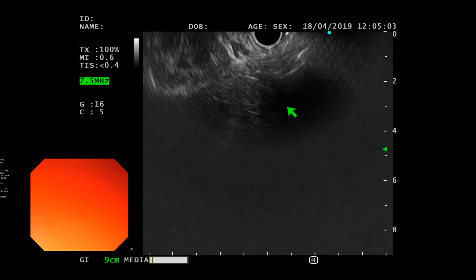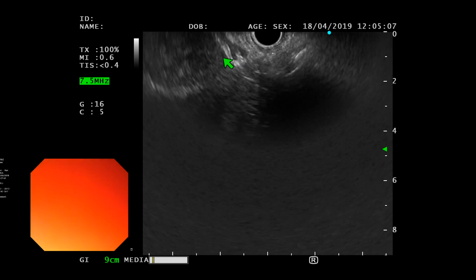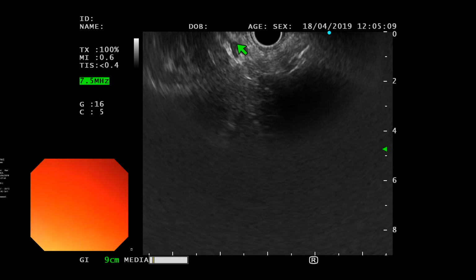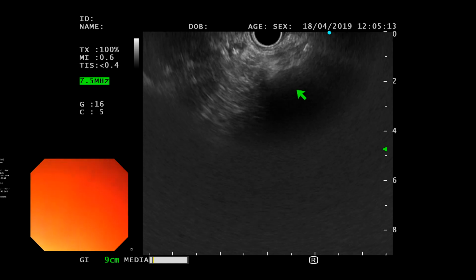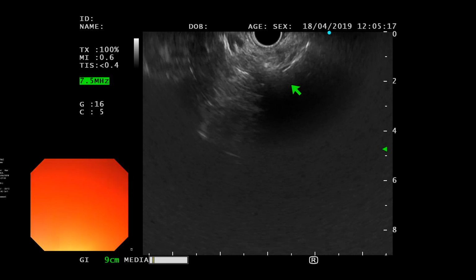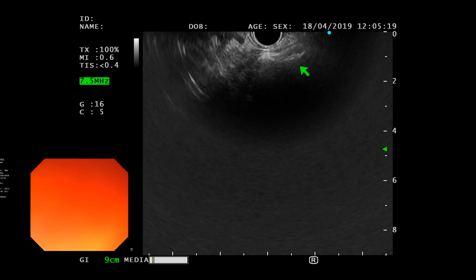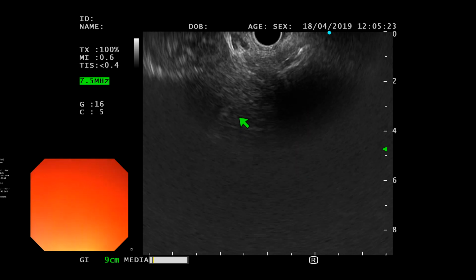Again, you put adrenal. This upper one is the adrenal, because you pulled, so it went away from you. Right on top of the kidney is the left adrenal. This is the adrenal, this is the kidney. And here, if you thumb down, pull down, you should have the spleen here. Yeah, this is the spleen right there.